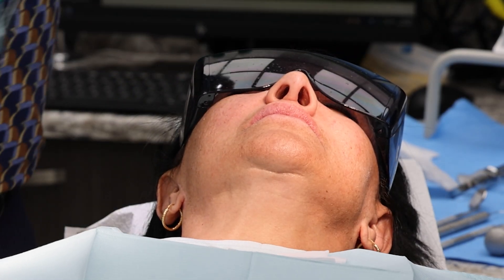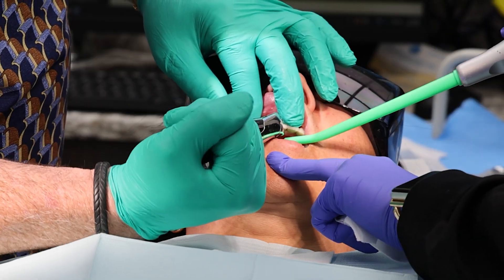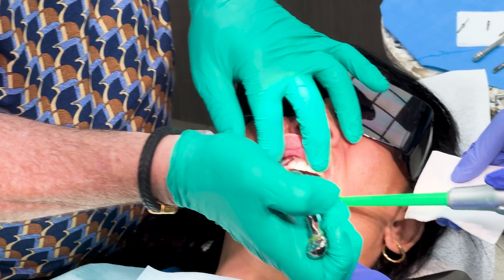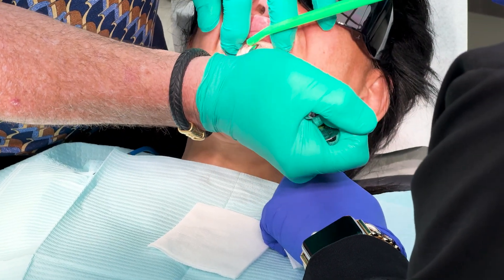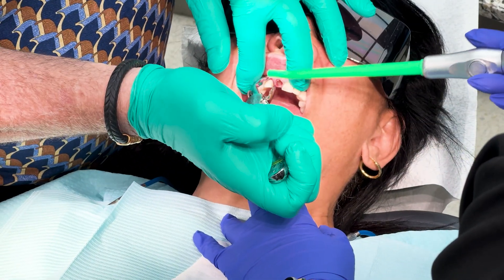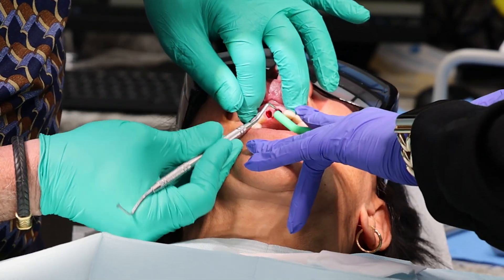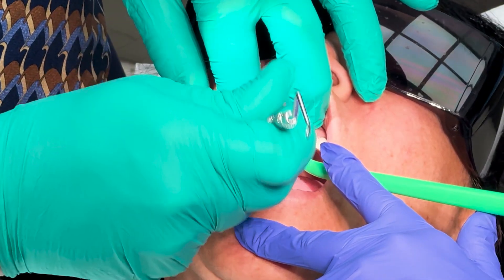All right, let's go ahead and start here. You should be all nice and numb — let me see if you have any discomfort. You're okay. One tooth is out. Both teeth are out. Now we're going to clean out that infection at the tip of the root. There's a lot of granulation tissue up here on this lateral especially.